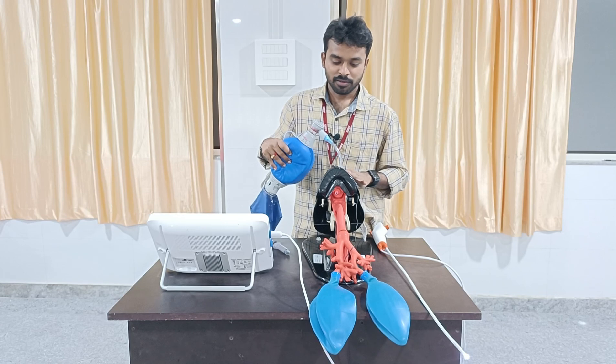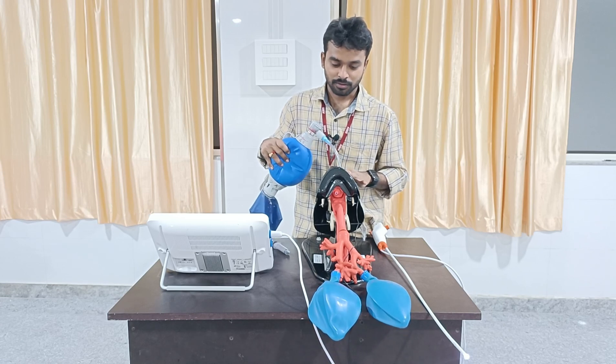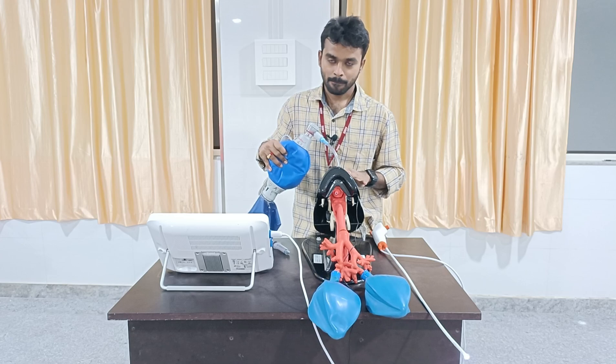After the placement of this tube, you can see the inflation of the cuff.